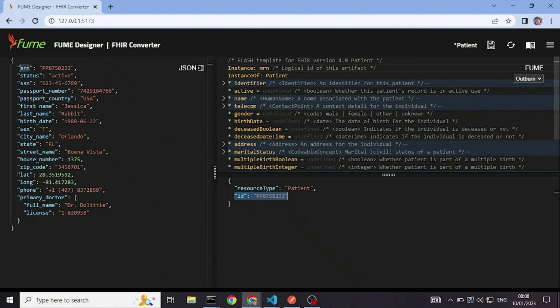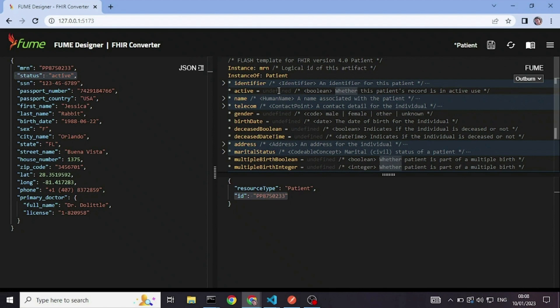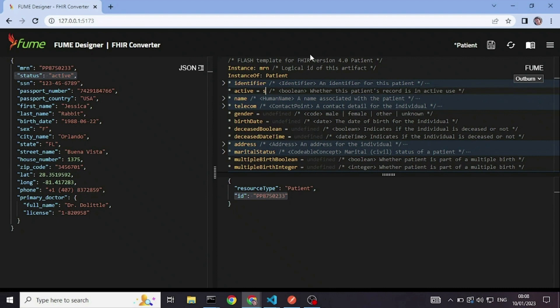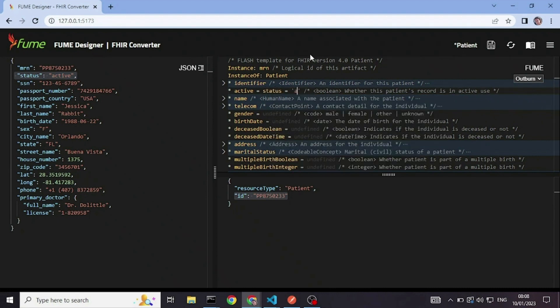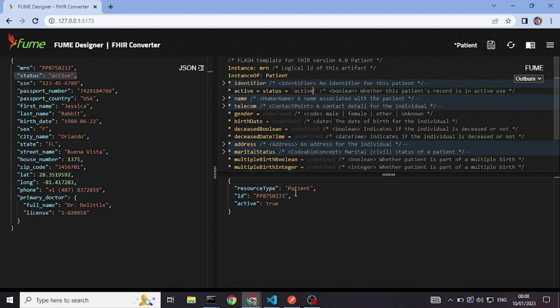Next, I will take the status active that I have in the source and I want to transform it to a boolean field for the active element. So I will just write the condition status active. And since the condition is true, I'm getting active true.